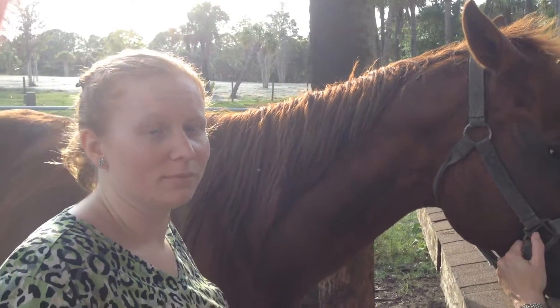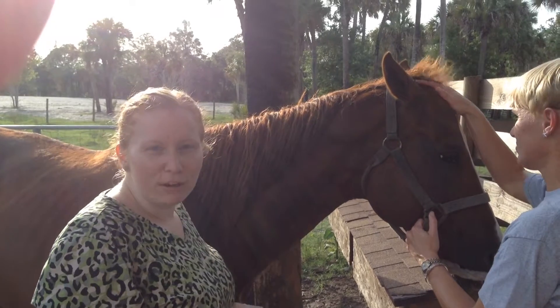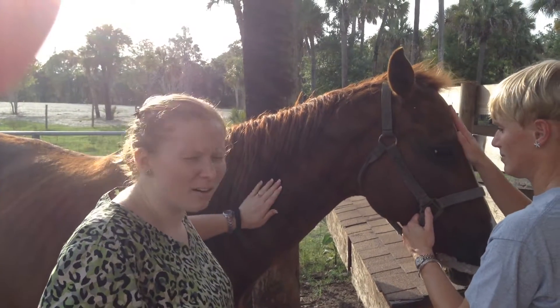We're going. I'm going to perform jugular venipuncture on my friend Playboy here.